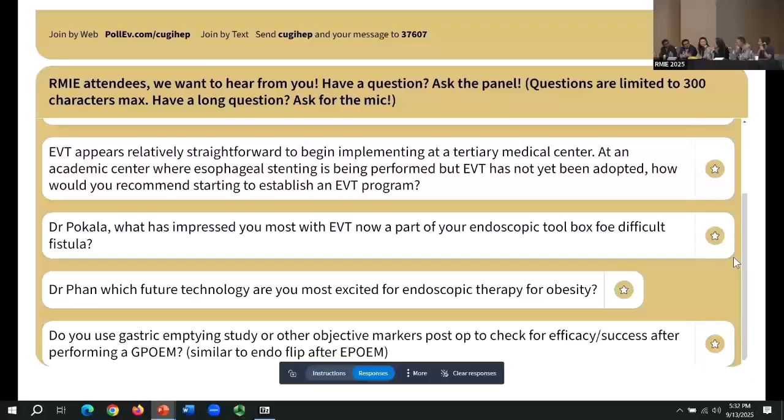I tried for a while suturing at the bulb because when you do endoscopy and go into the bulb, you take a sharp right turn to the second portion at the apex, right? So I thought, maybe if I don't extend the proximal end to the antrum, that might reduce the risk of migration. So for a while, I was trying to place the proximal end in the bulb. The problem is the bulb is very, very thin. It easily ulcerates, and overgrowth occurs quickly. So there's no easy solution. We need a better duodenal stent. I think that really is one takeaway here: industry needs to deliver, since they're already partly available in other parts of the world. We need better duodenal stents.